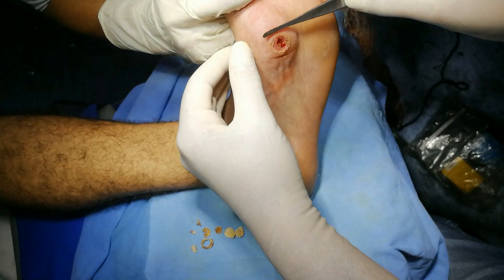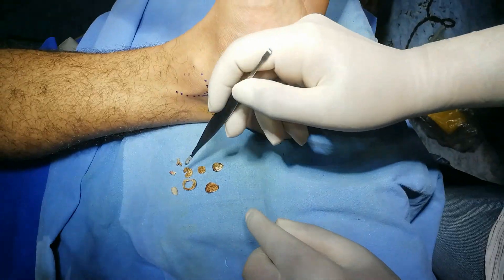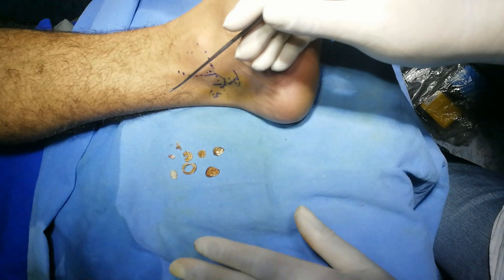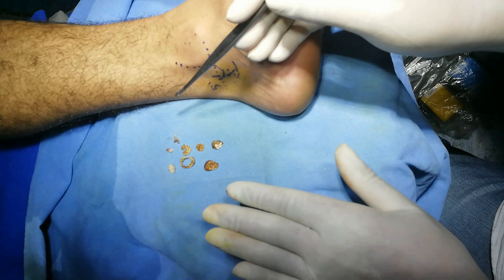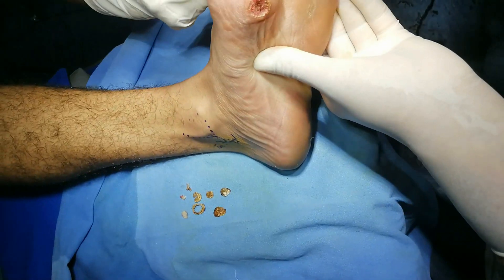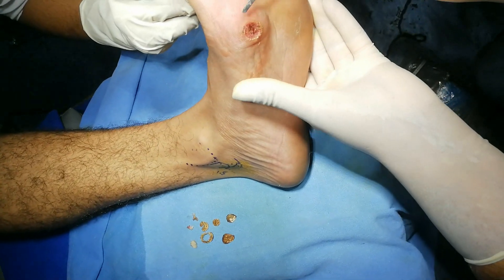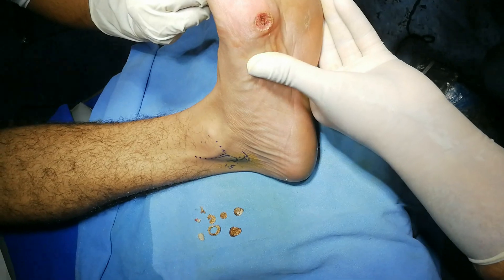There are a few pin-point bleedings at two points. After eight passes of RF, I have totally removed the callosity and the wound — as you can see — is quite clean and there is nothing exposed in the base. This is likely to heal in time and there is hardly any pressure.